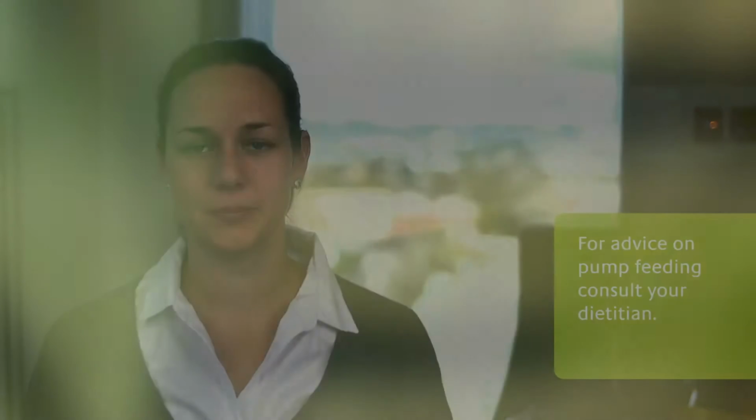Here are some extra FAQs that we are often asked and you may find helpful. Avoid using the plunger on the syringe as forcing feeds in too quickly may make you feel uncomfortable. You can still eat with a gastrostomy tube unless your doctor or speech pathologist tells you it is unsafe. You should only put the prescribed nutritional formula, water or medications through the gastrostomy tube. If you require pump feeding, your dietitian will show you how.